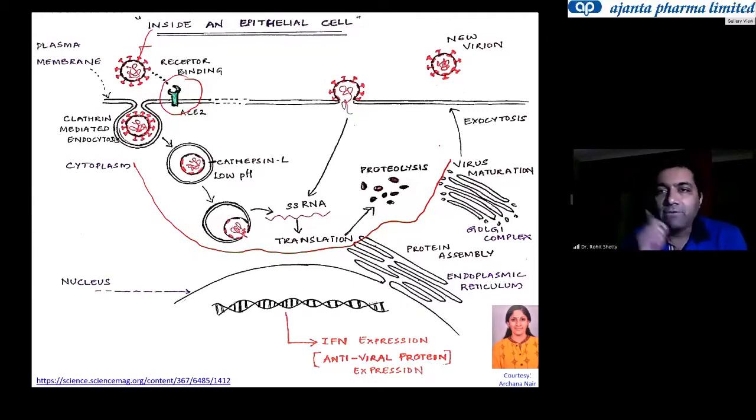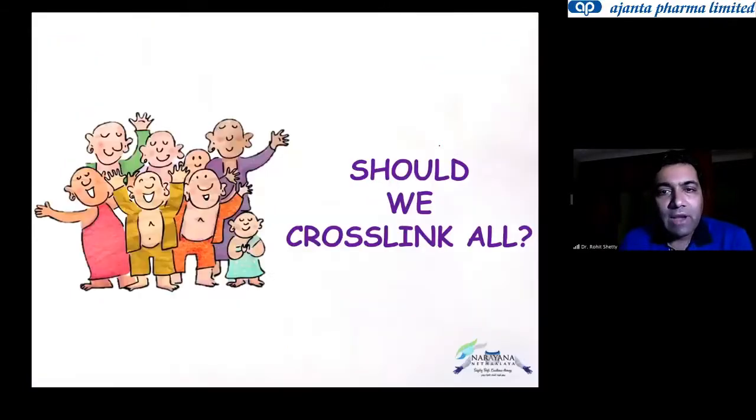If you are breaching something, see, this is how the epithelial cells of a cornea are conducive for COVID, and everything in cross-linking is on epithelial cells. Somebody said, "Oh, we use UV light," but here you're using UVA. UVC kills virus. So now, what do we do and when do we cross-link?